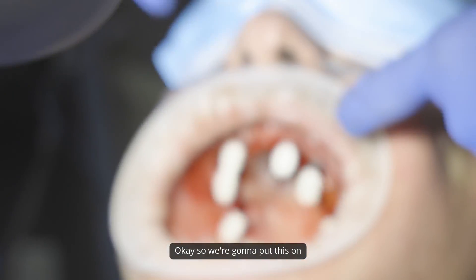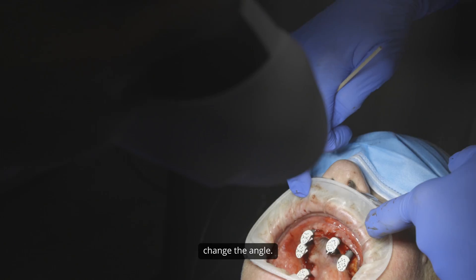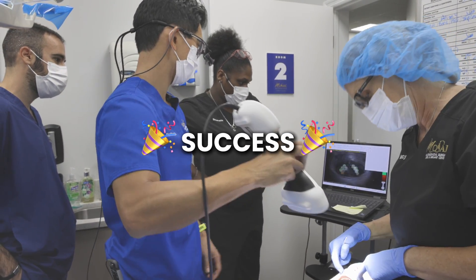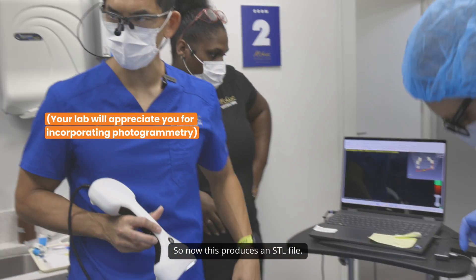Okay, so we're going to put this on now. Move it over, change the angle — it's great that you can hold it up high and it still captures everything. And that's how long it should take. Now this produces an STL file.